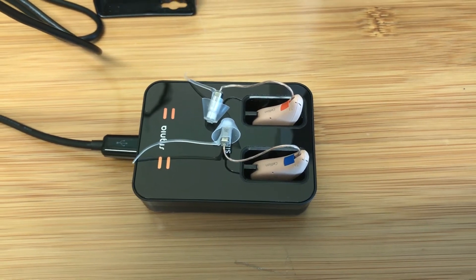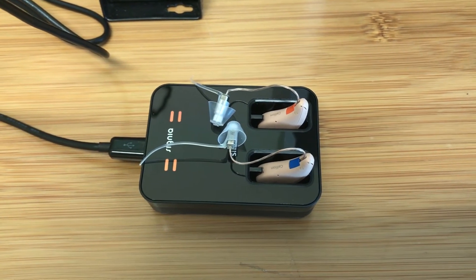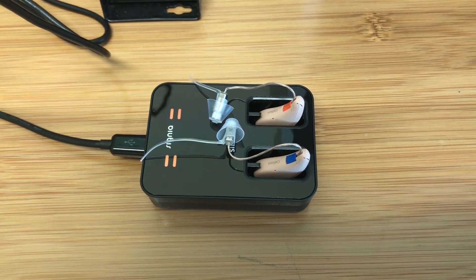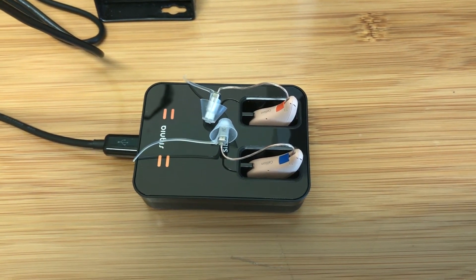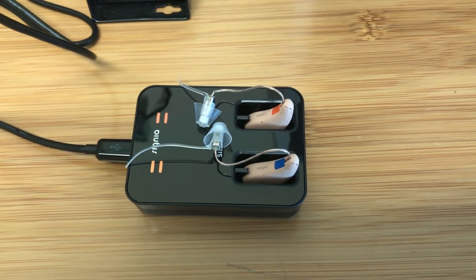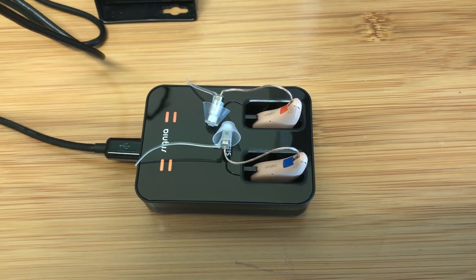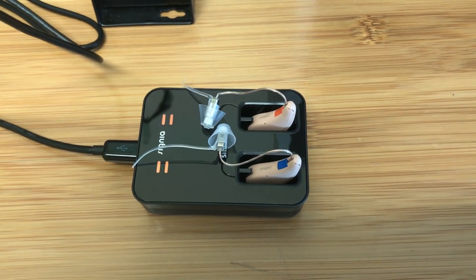I love these things. Other companies sell these exact same hearing aids, but we sell them for thousands less. So before you buy, give us a call, check our prices, set up a free consultation which includes a test, and let us show you we also provide excellent service. Thank you.